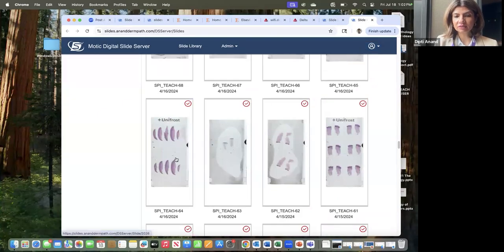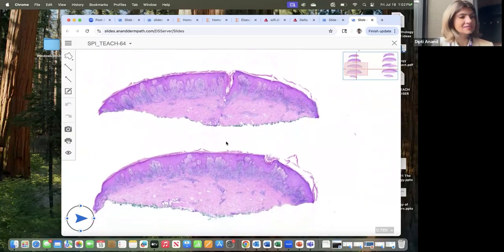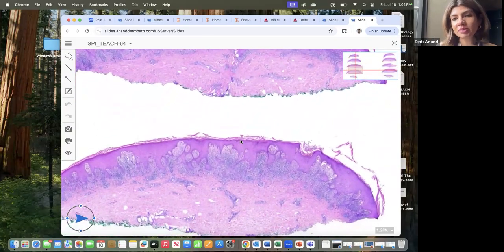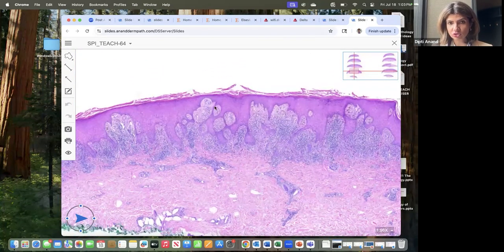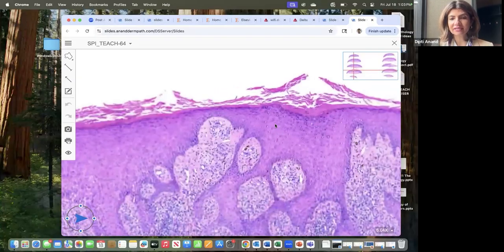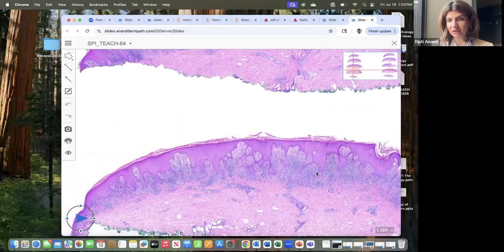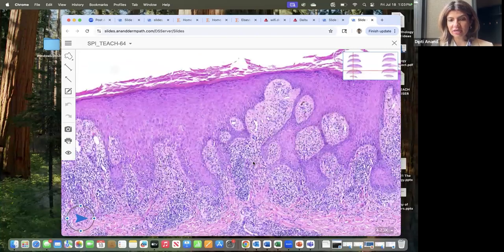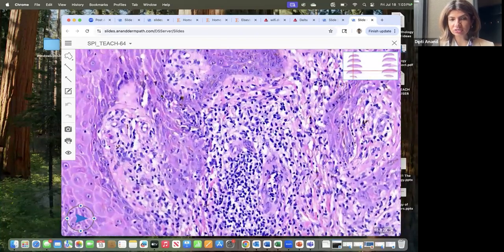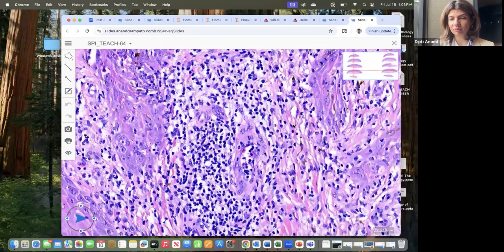Okay, then the last thing in lichen planus that I'm going to talk about is hypertrophic LP. Hypertrophic LP is a disease entity which clinically mimics a squamous cell carcinoma. It most commonly occurs in the lower extremities. What you see is a variant of LP with a lot of epidermal acanthosis. So you see a very thick epidermis, and you also see hypergranulosis. The lichenoid pattern of inflammation may die off, but what is left behind is again this jaggedy, irregular sawtooth acanthosis. And if you look at the bottom at the DE junction, you can see the nice vacuolar alteration and the necrotic keratinocytes. And then there is going to be the pigment dropout.